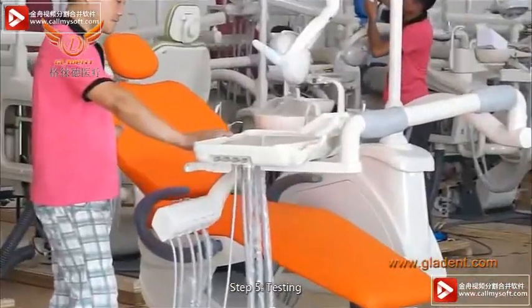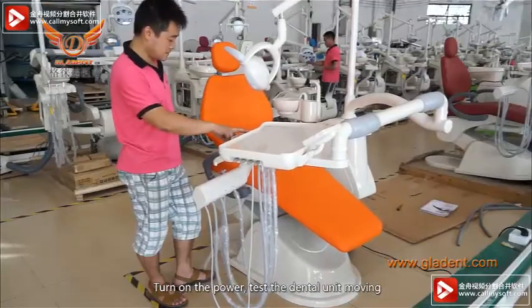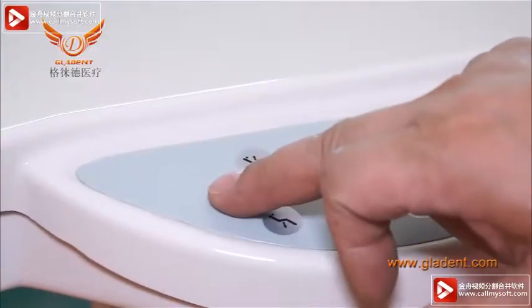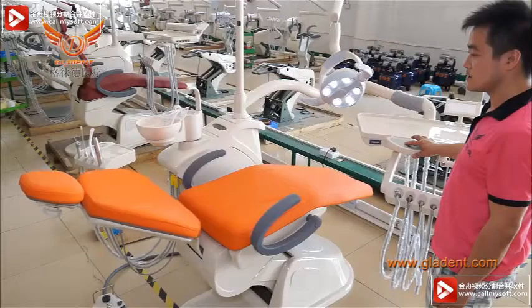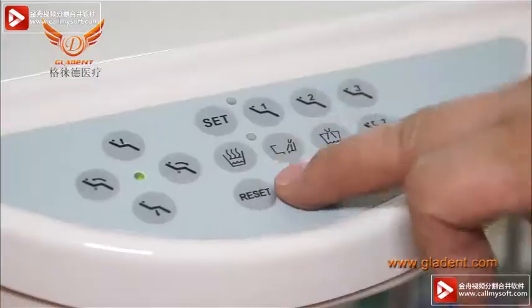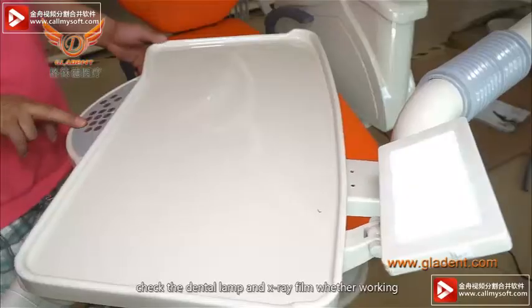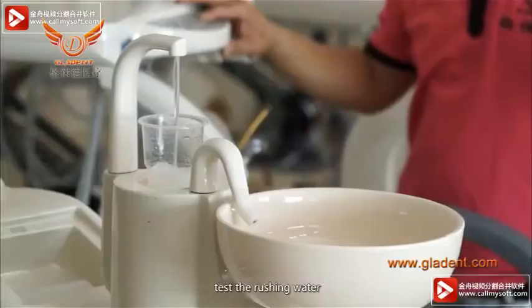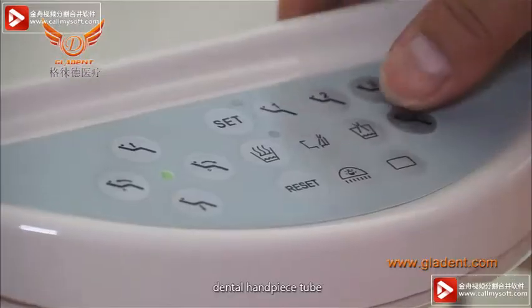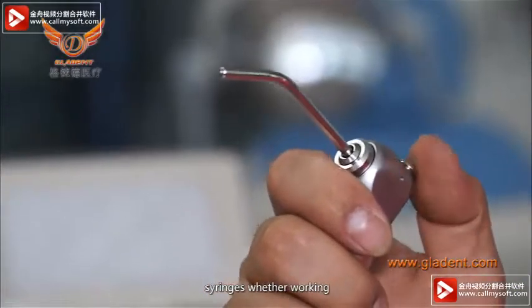Step 5. Testing. Turn on the power. Check if the dental unit is moving. Check the dental lamp and X-ray film viewer to see if they are working. Test the running water, dental handpiece tube, and syringes to verify they are working.